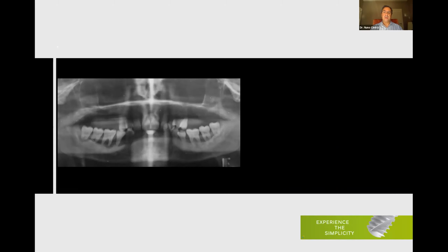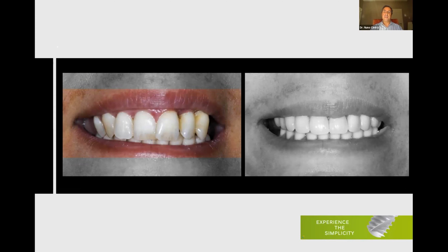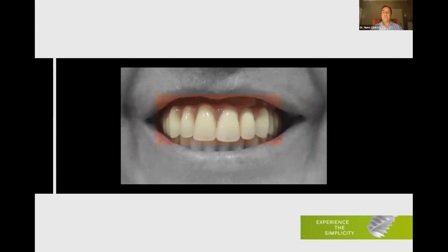And as you can see, this is a pre-op X-ray and post-op X-ray. Look how much bone we had to reduce in order to uncover this gum, in order to make sure that when the patient smiles, you don't see the transition zone between the prosthesis, the false gingiva, and the natural gingiva. This is absolutely unacceptable. And this happens because the bone reduction was not enough. The implants should have been placed in a higher position. If the implants were in a higher position, the transition zone, when the patient smiles, is not noticeable. So this is not a lab problem. This is not the fault of the lab. This is a surgical problem, because during surgery, we didn't reduce enough bone.